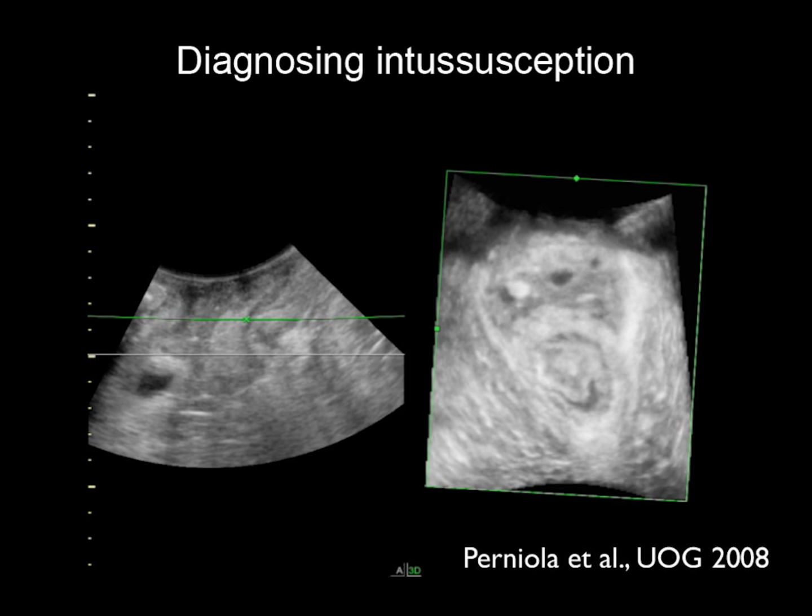And then there's intussusception, which is something that urologists and gynecologists very rarely diagnose. That's the axial plane, that is the mid-sagittal. Here's the anal canal, which is still kind of tubular here. But look what happens here. This is not stool. This is not stool.